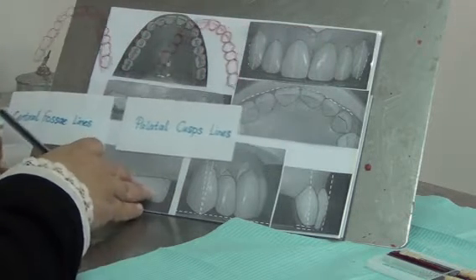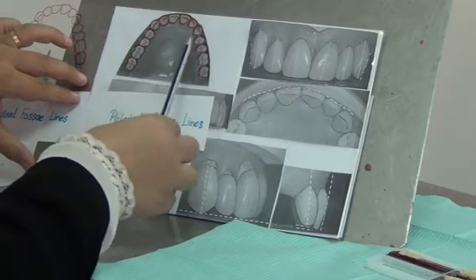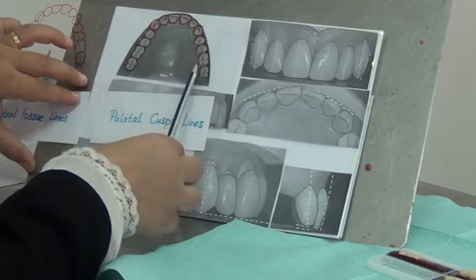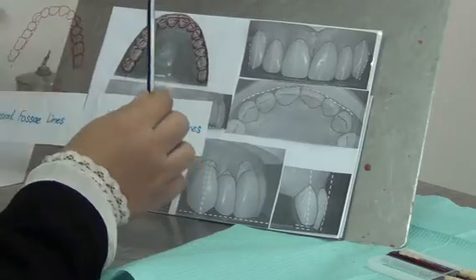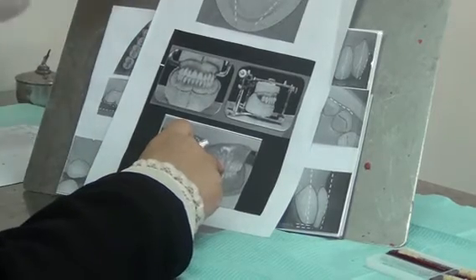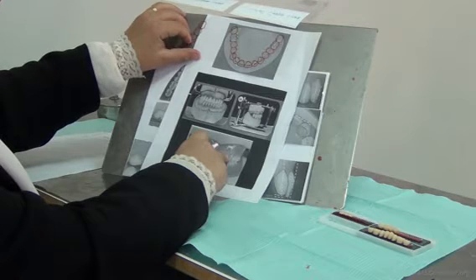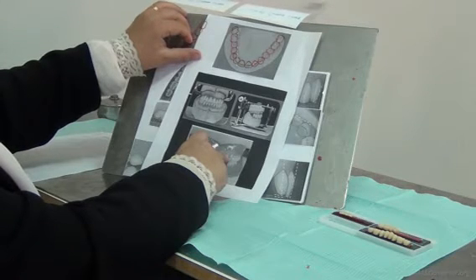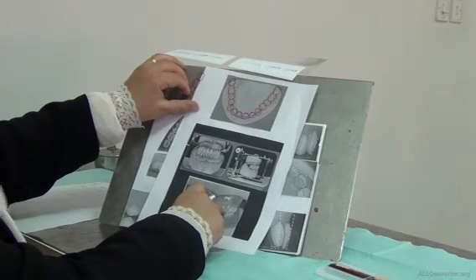And the palatal upper cusps in these areas, the tips of the cusps, not the palatal outline, but the line joining the tips of each cusp of the upper, is coinciding with the lower crest line. So if we invert this, the upper is going down on the lower. We find that the palatal cusps of the upper are aligned exactly over the middle of the crest of the lower. So these are our reference lines.